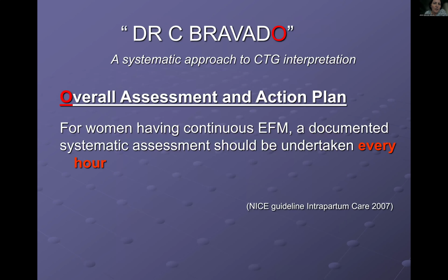All right, and so after you've assessed your CTG, you need to make your overall assessment and action plan. You need to document this periodically, and you're going to decide, okay, do I need to intervene or not? Do I need to add more oxytocin, for example? Do I need to do a vaginal delivery? Do I need to do forceps or vacuum? Do I need to do a cesarean? Do I just need to change position for the patient? Okay, so that's your DR C BRAVADO.